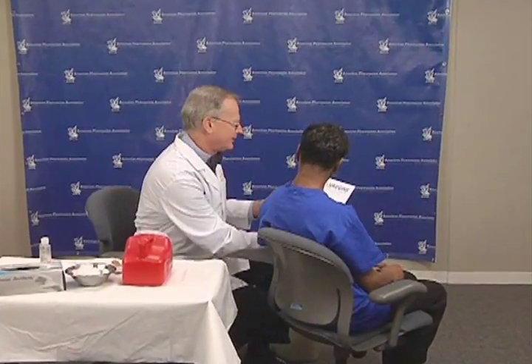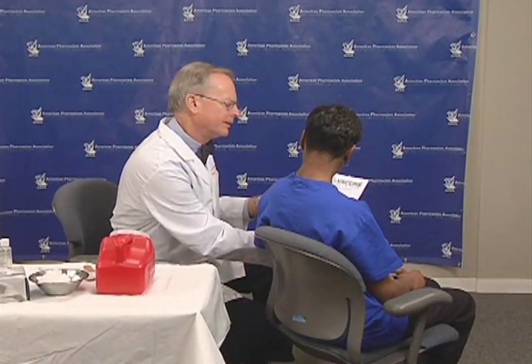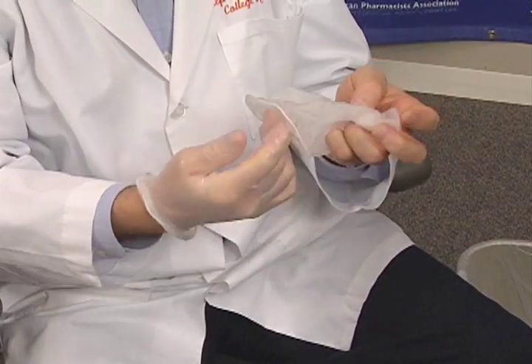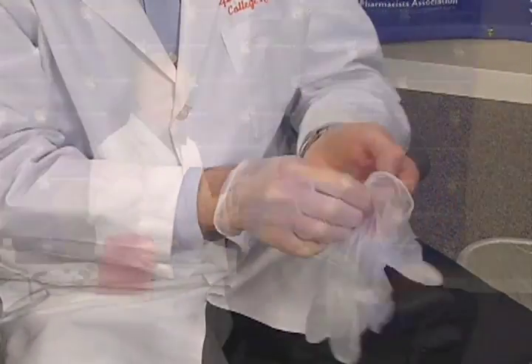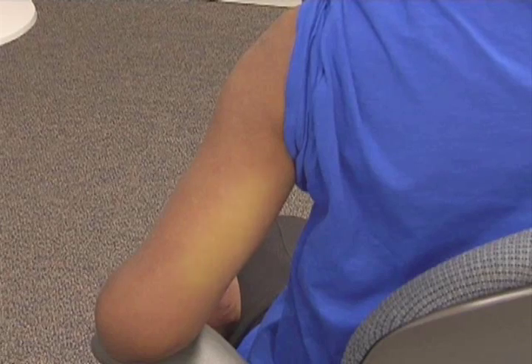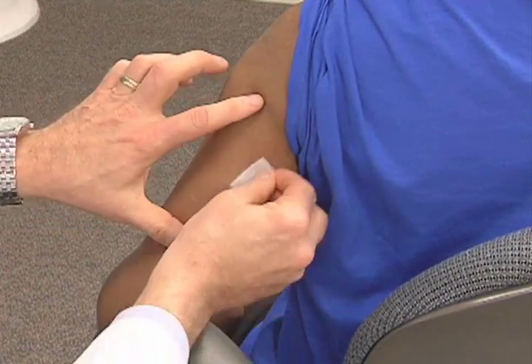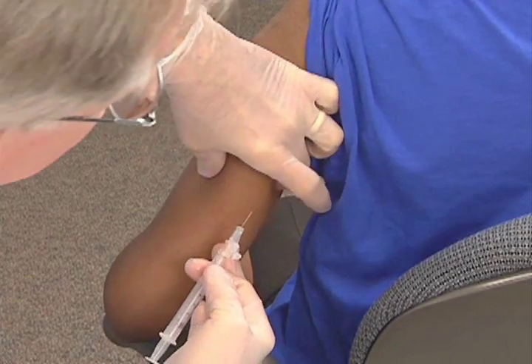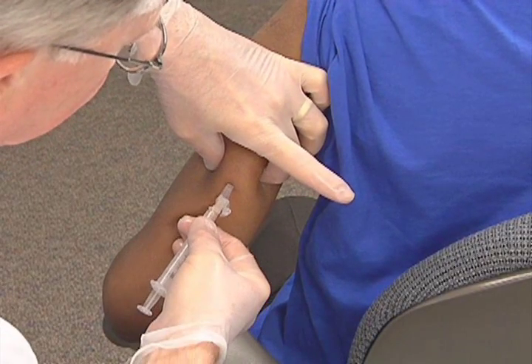Once you are ready to inject the vaccine, although gloves are not required, it may be prudent to use gloves for your protection and patient perceptions — follow your local standards. Be sure your patient is sitting. Expose the injection site, which is on the posterolateral aspect of the upper arm. Swab the injection site with alcohol and allow the alcohol to dry. Note that the sharps container is readily accessible. Hold the syringe near the hub, pinch a fold of skin, and insert the needle at a 45 degree angle to the hub of the needle.